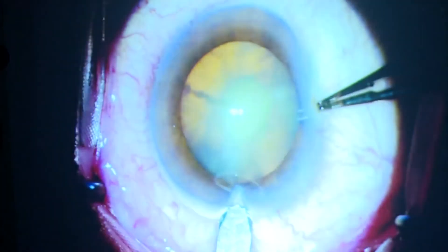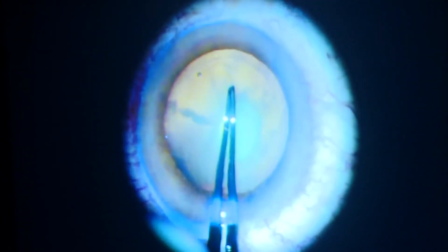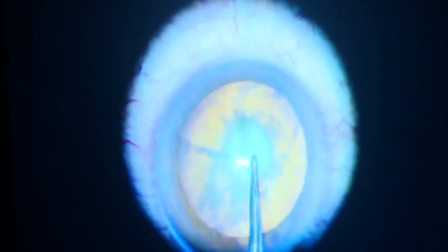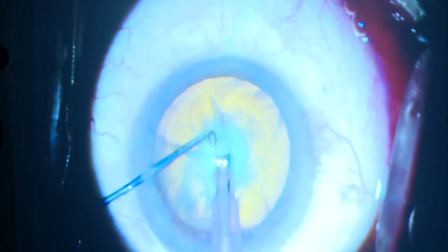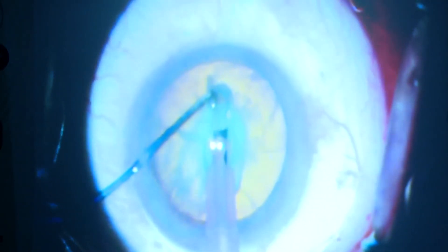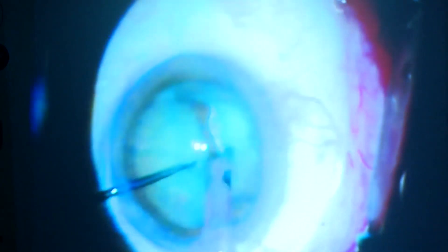This is another patient wherein there is another posterior capsule rupture in a PPC. Align the rhexis in such a way that you are not parallel — the incision should also not be parallel to the posterior capsule rupture. Oval rhexis is the answer. You have to save the situation. This oval rhexis done, which is a two-in-one rhexis — a modified technique — wherein you do not want to rotate the nucleus. You do not want to do any hydrodissection or hydro-delineation. After sculpting, separate into two, right from the proximal to the distal — totally separate it. Cross-chopping is the answer. The nucleus pieces adjacent to the six o'clock position are taken care of and adequately managed.